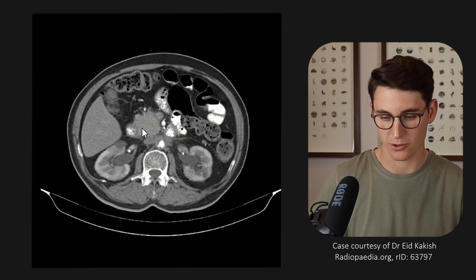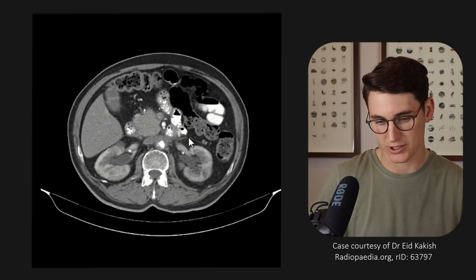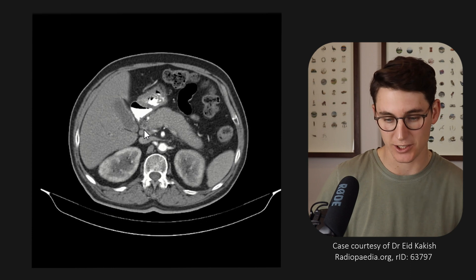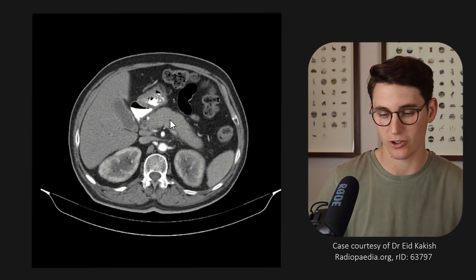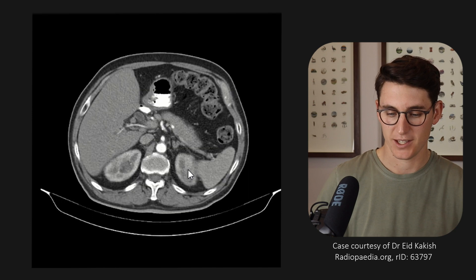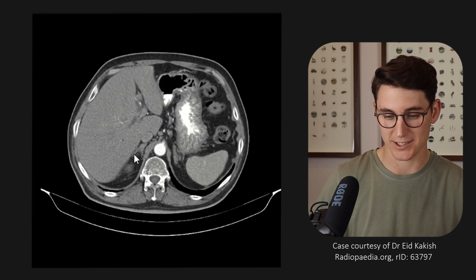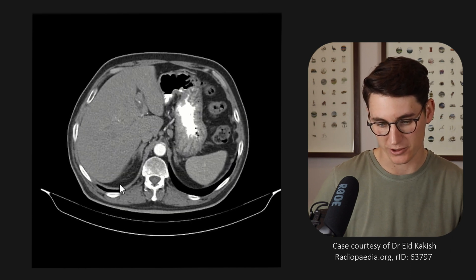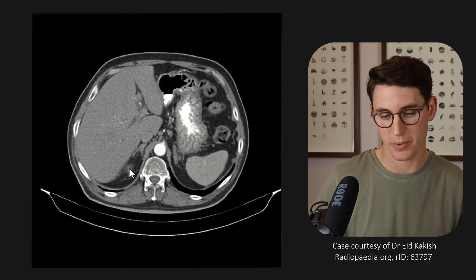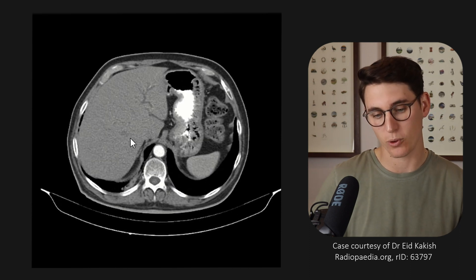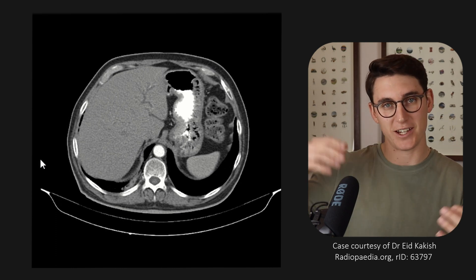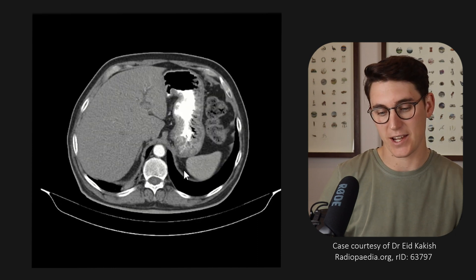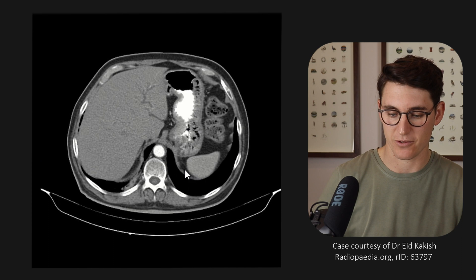We can see that anterior to Gerota's fascia will be our anterior pararenal space that has our duodenum, our descending and ascending colon, as well as our pancreas. As we head up superiorly, we can see our adrenal glands still within our perirenal space, and we can see our posterior pararenal space closing out here. The right-hand perirenal space will eventually come to the bare area of the liver, which doesn't have any parietal peritoneum and comes in direct contact with the right diaphragm. On the left-hand side, that left perirenal space opens up to the left diaphragm.